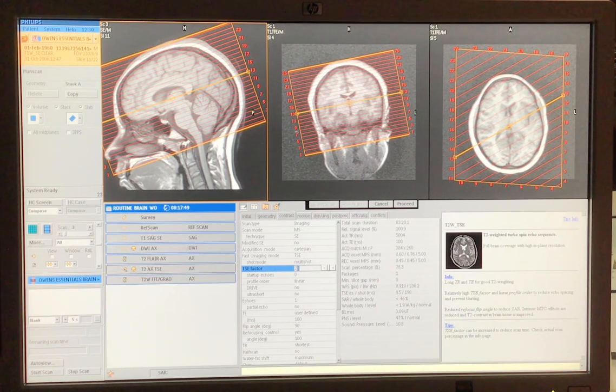I have a quick question. Yes. Okay, so I just want to make sure I heard you correctly. So for the TSE for T1 image is 2 to 4, and then T2 is 15 and higher? Yes. Yep. And then for the T2, like 15 and higher, how high does that go?